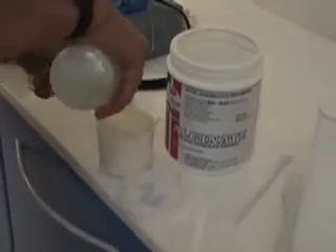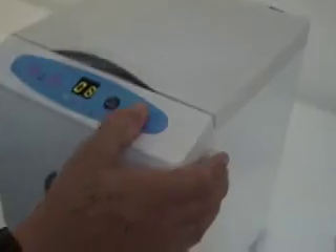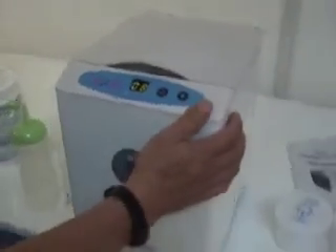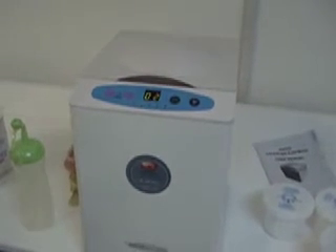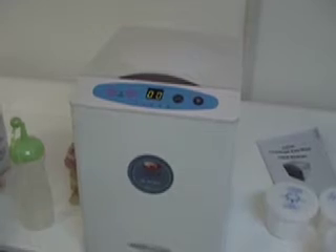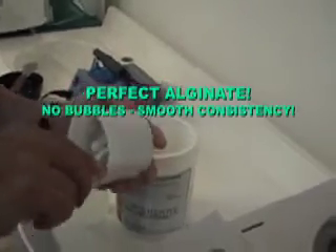Simply mix your alginate with water, seal your cap, place your jar inside the centrifuge, close the lid, hit the start button, and exactly 8 seconds later you have your perfectly mixed alginate, ready for impression, with no bubbles and a smooth and uniform consistency. It's that simple.